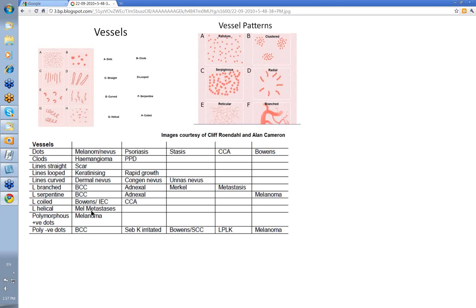Helical vessels — we've said melanoma metastasis. And polymorphous various types with dots is a feature of melanoma. Polymorphous without the dots can be any of these: BCC, irritated seborrheic keratosis, Bowen's, LPLK, and melanoma.